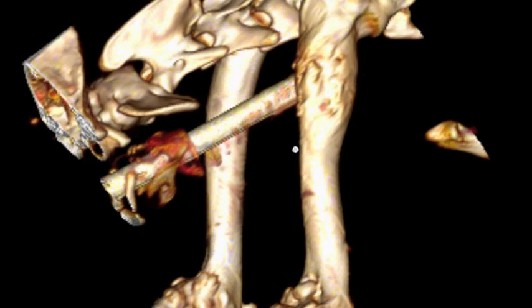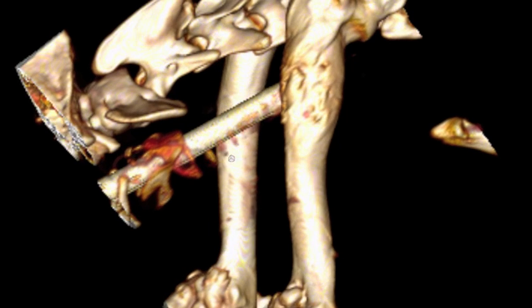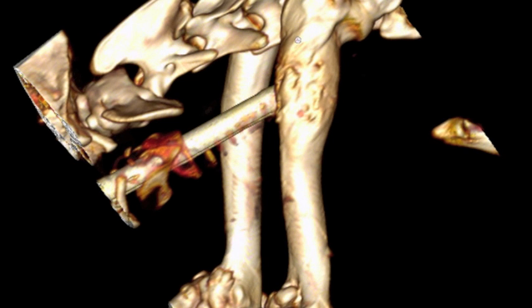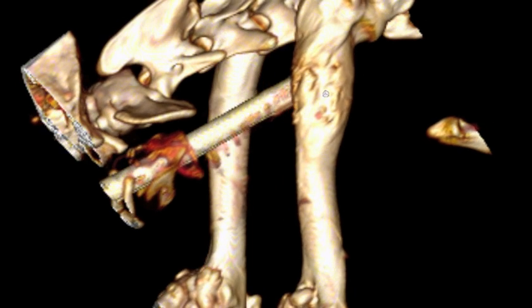This is a three-dimensional volume rendering of this patient's humerus. In the proximal humerus, we can see where there's some expansion of the bone due to invasion and expansion of the tumor. You can see that it's in the proximal diaphyseal, metaphyseal region on the left humerus.